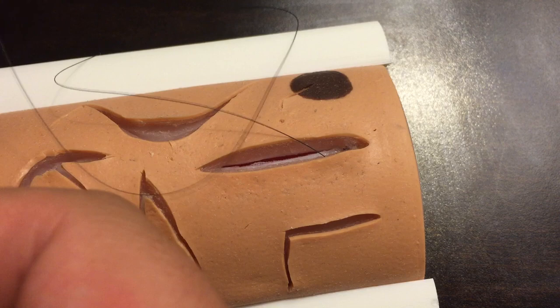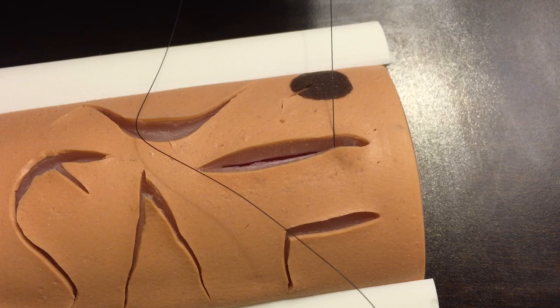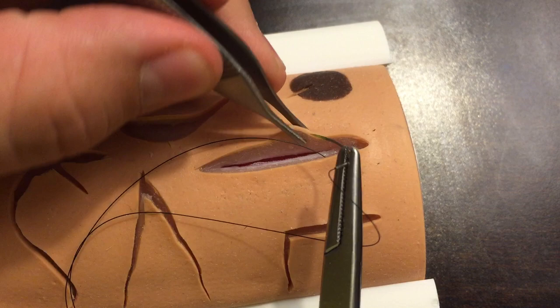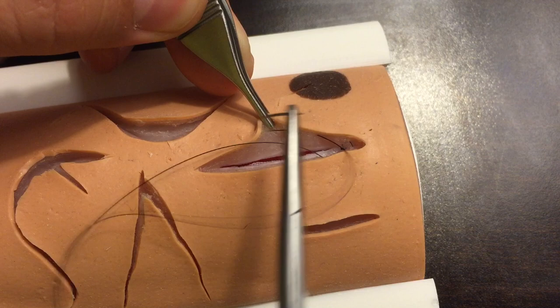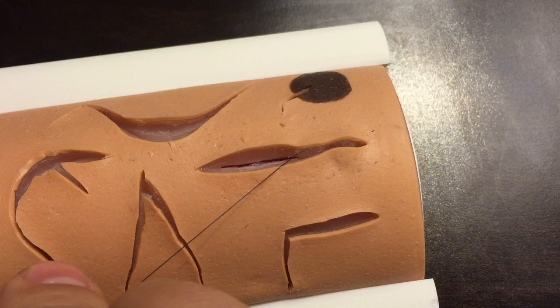Now I'll load it again. Because I've thrown another suture, I can see that I need to enter on the other side, exactly across — perpendicular. Remember: when suturing, we never want our pass to be going at an angle because then it's going to pull the skin at an angle. We want to go straight across, starting subcutaneous, staying just under the epidermis, and exiting a little further down on the laceration or incision.